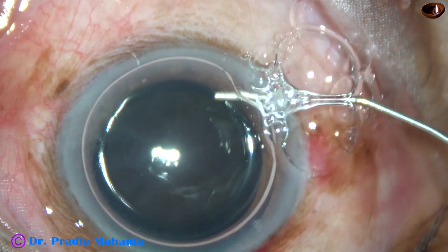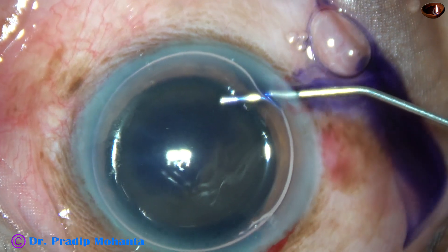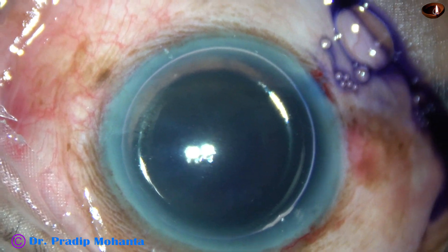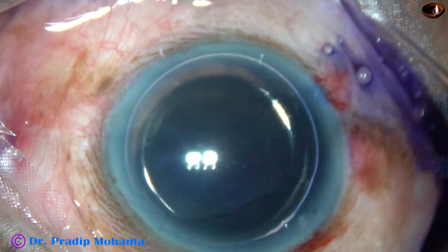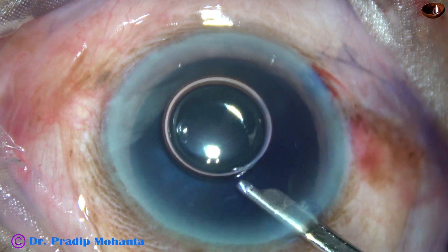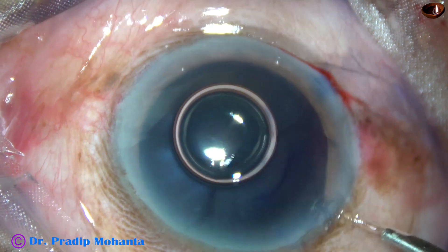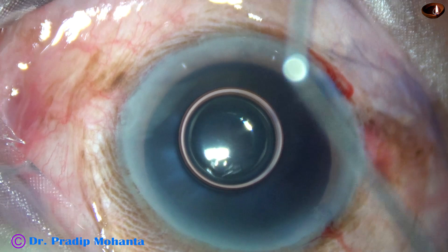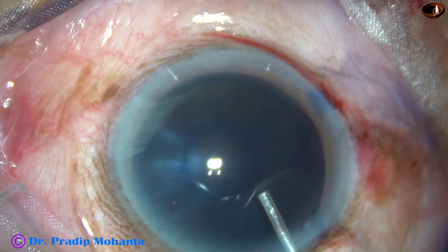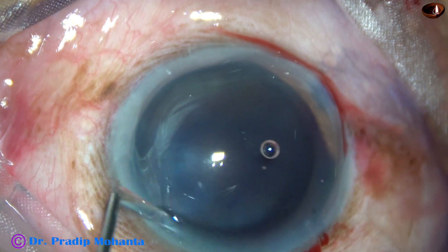Now I inject an air bubble, and underneath this air bubble I apply trypan blue dye over the anterior capsule of this very hard cataract. Nucleus sclerosis in this case is grade 6. The dye is now washed out with BSS, and after washing the dye out of the anterior chamber, 2% hydroxypropyl methylcellulose is injected into the anterior chamber. The HPMC is applied over the cornea also for better visibility.